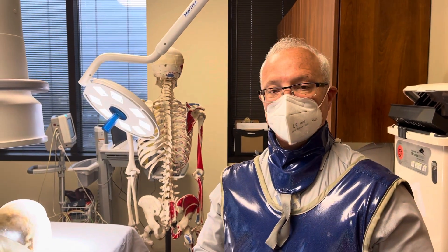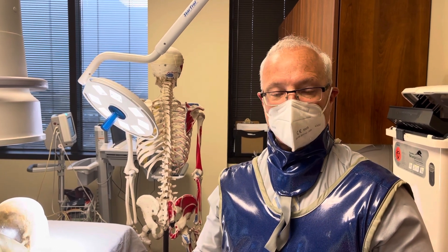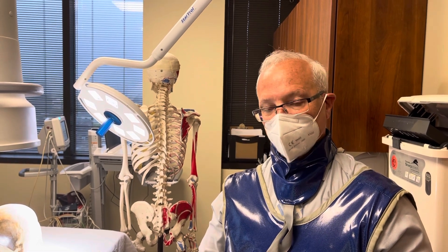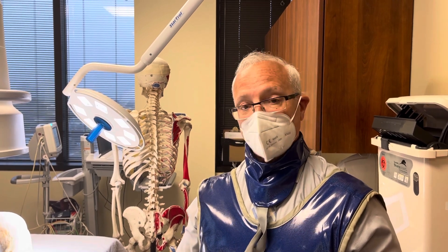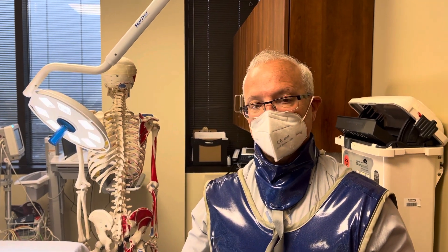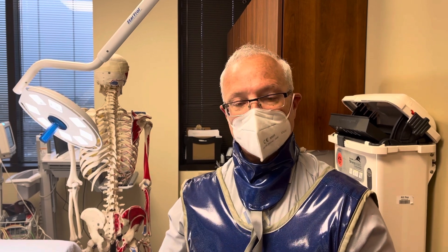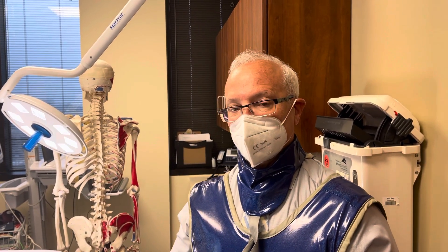Hello, this is Dr. Kenneth Candido from Chicago demonstrating the techniques of atlanto-occipital and atlanto-axial joint injections. The C0-C1 and C1-C2 joints are not really true diarthrodial zygapophyseal joints, but there is a capsule. I'm going to talk about the use of this technique for mediating and mitigating the pain associated with cervicogenic headaches, rheumatoid arthritis, and nonspecific neck pain where there is not an identifiable cause aside from the atlanto-occipital and atlanto-axial joints.